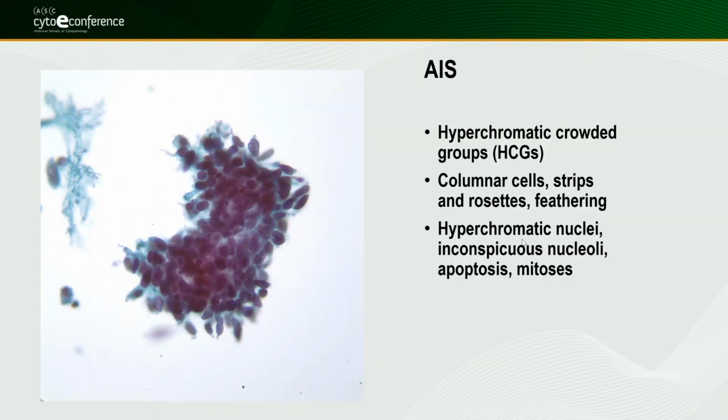So then the next one would be AIS. So we said favor that. Then when do we push it for AIS? AIS is when you see the cells even falling off at the edges. That's called feathering. And everything is even more disorganized and crowded, and the cells falling off on the edge. And so that's AIS.